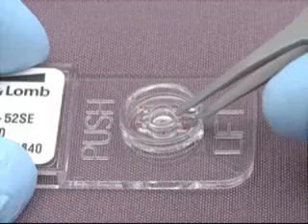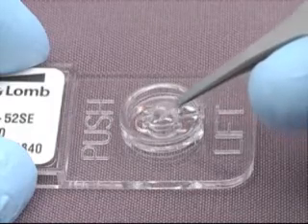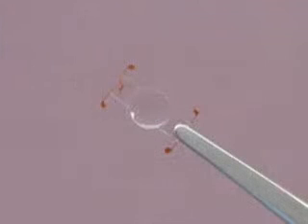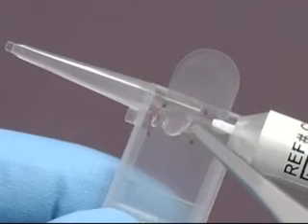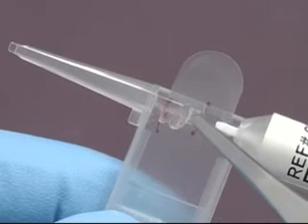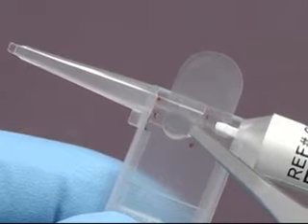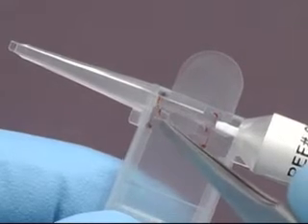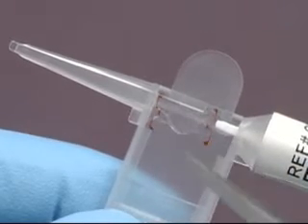Using non-tooth forceps, carefully remove the CrystalLens from its case and confirm that the more rounded loop is to the right side of the leading haptic to ensure that the lens is loaded anterior side up. Place the lens onto the loading area as shown, so that the leading plate haptic is tangent to the body and position the leading right loop under the lens track edge.